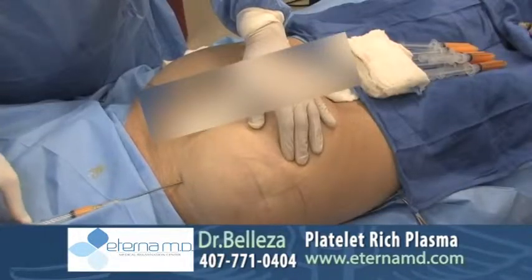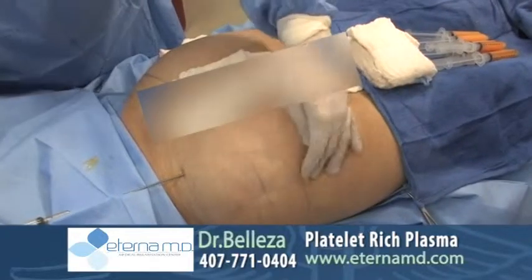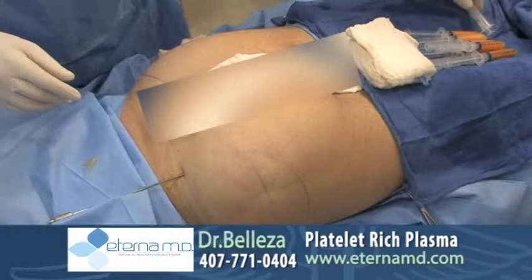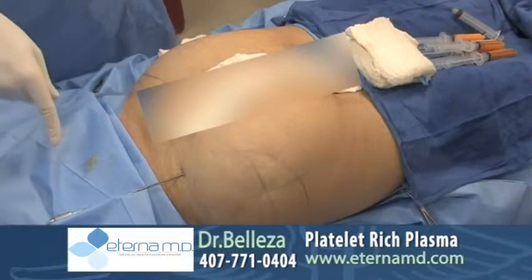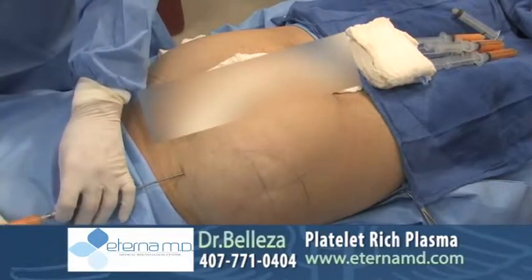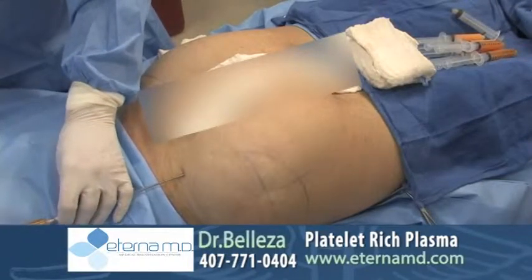You can notice here that the right glute actually appears a little bit smaller compared to the left glute from the beginning of the procedure. This is because the patient has a history of some scar tissue that was built up in the right glute. So here we're trying to correct this by making each glute have the same volume and look the same proportion.